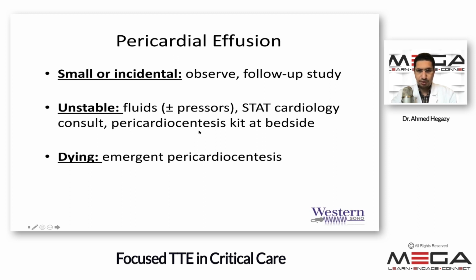You need the pericardiocentesis kit at the bedside in case the patient crashes, in which case the patient will need an emergent pericardiocentesis right then and there. Otherwise, if they're on pressors and they're relatively stable, I will usually get the cardiologist to do the pericardiocentesis. And if they're obviously dying or if they arrest, then pericardiocentesis needs to happen emergently. And usually the most senior person in the room should do that drain.